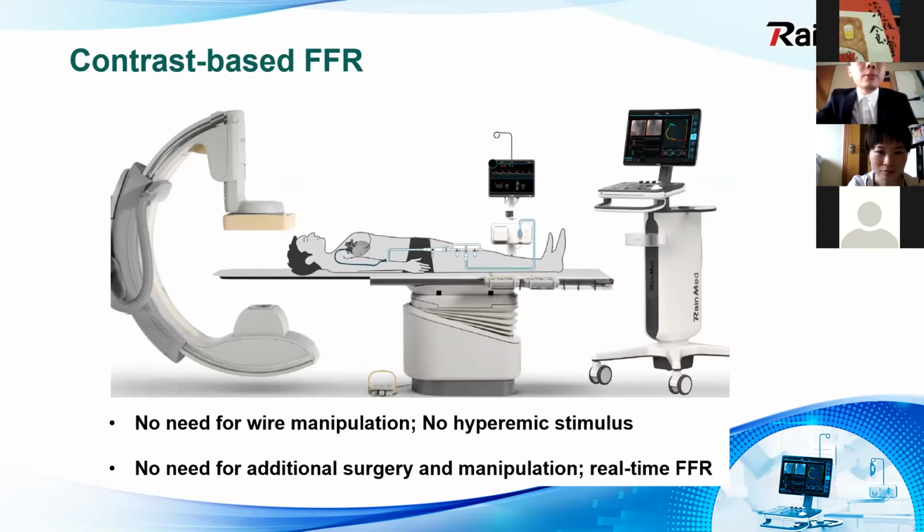It has no need for wire manipulation and no need for hyperemic stimulus. There is no need for additional surgery and manipulation, and we can get the real-time FFR.